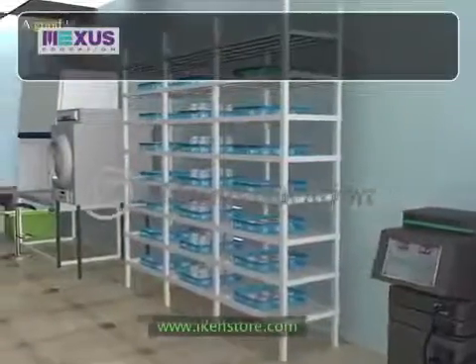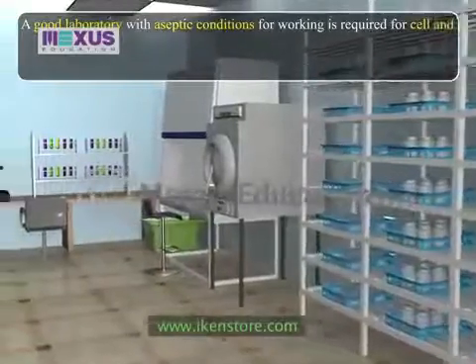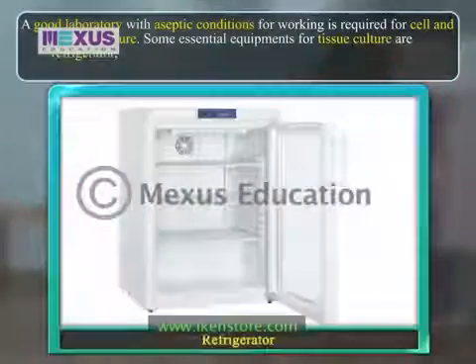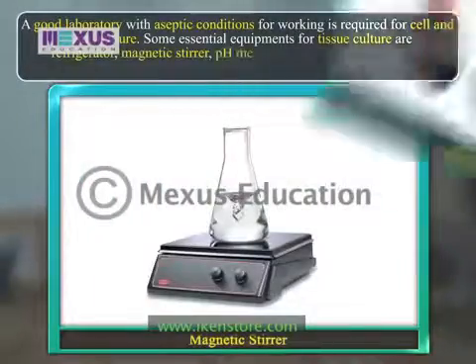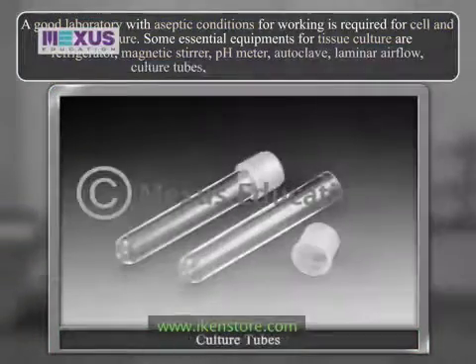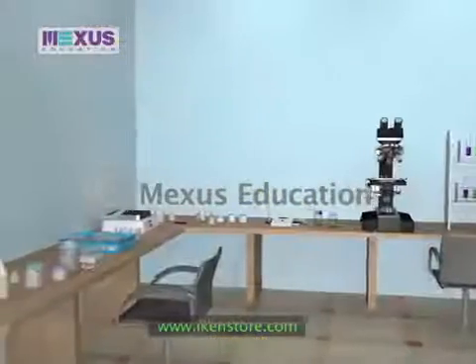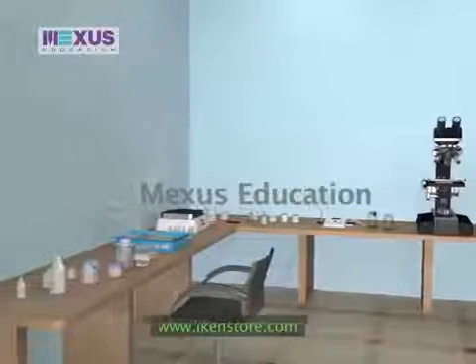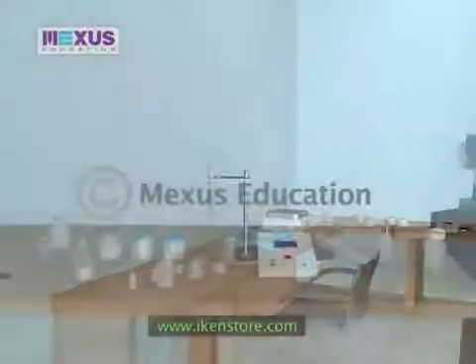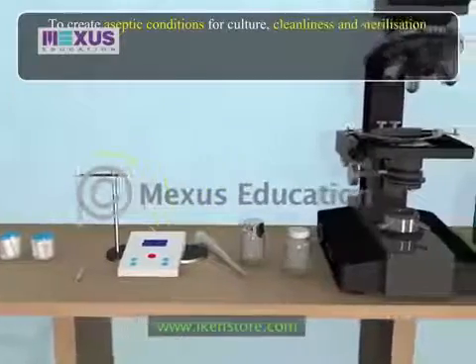A good laboratory with aseptic conditions for working is required for cell and tissue culture. Some essential equipment for tissue culture are refrigerator, magnetic stirrer, pH meter, autoclave, laminar airflow, culture tubes, flasks, petri dishes, etc. Besides, arrangements for maintenance of suitable temperature, humidity and illumination are also needed. To create aseptic conditions for culture, cleanliness and sterilization of glassware is very important.